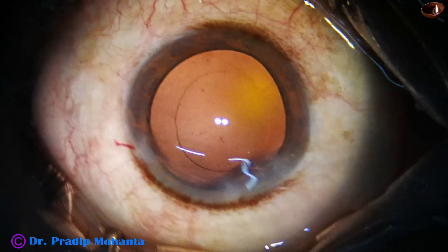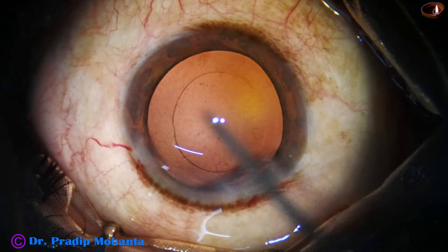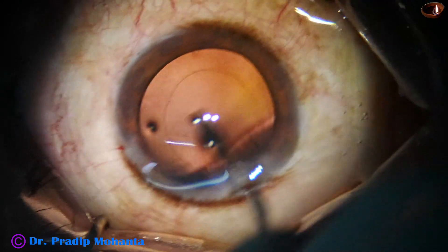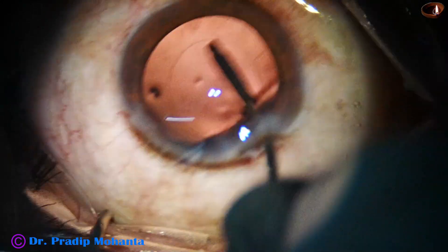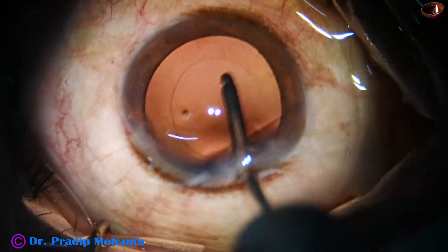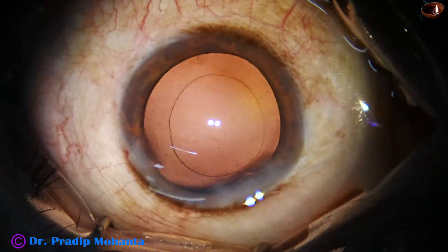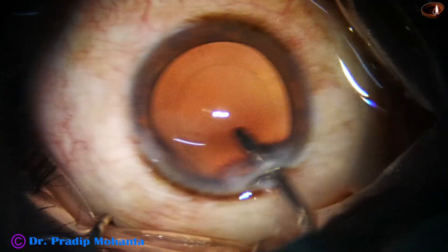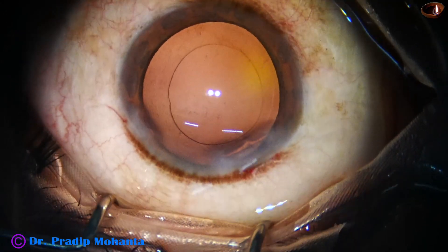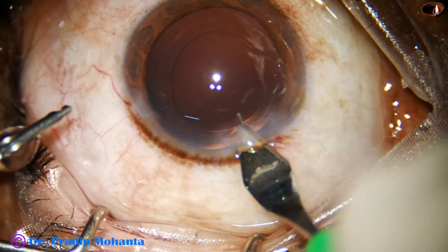Now is the time to implant an intraocular lens. This is hydropolish — just by irrigation the posterior capsule is polished. A single piece monofocal intraocular lens will be implanted in the bag.